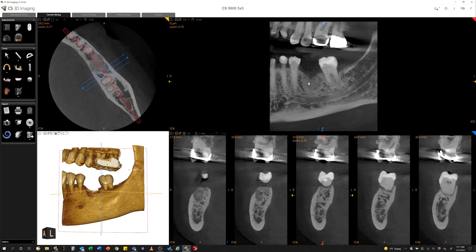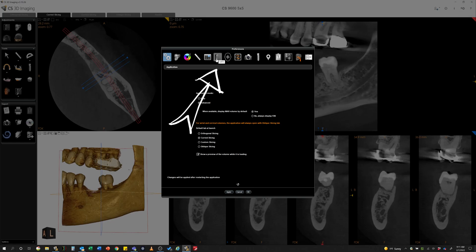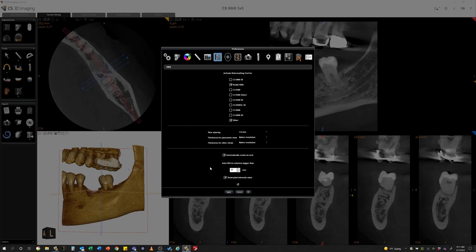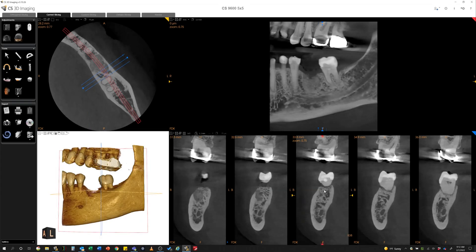I'm going to show you how to turn this on in the preferences. We're going to go up to the gears where it says Edit Preferences. In the MPR tab in preferences, we have a toggle that says Show Pixel Intensity Value. If you check that and then click Apply or OK, you will need to close and reopen the radiograph in order for this to show up. But I'll show you the practical example we have here.